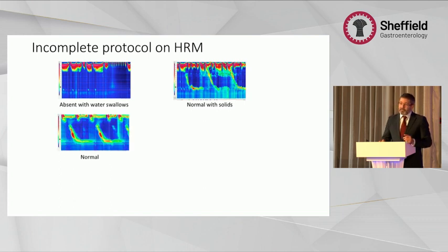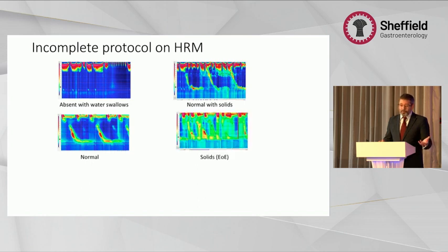On the other hand, here are cases where this is a patient who had absolutely bog standard normal physiology with 5 ml water swallows. But the patient was complaining of hold-up and dysphagia. When you give solids, suddenly you see that there's an obstruction.